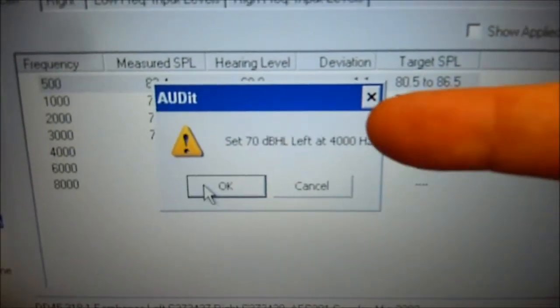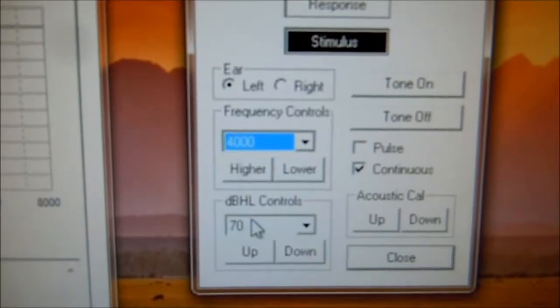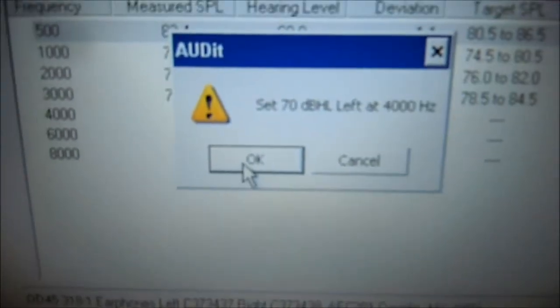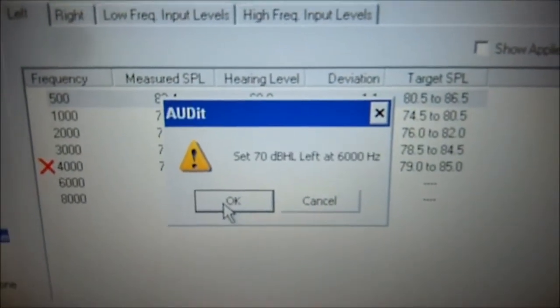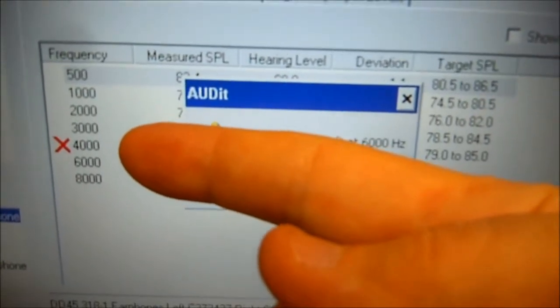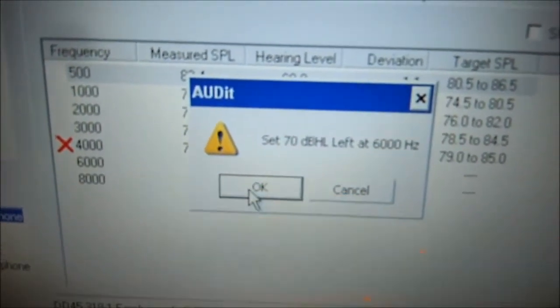Now it asks 70 dB at 4,000. Come back to the audiometer software, select 4,000, 70 dB. Tone's already on. Come back to the audit software and press OK. Now it says 70 dB at 6,000. Also notice off to the left here there's an X — that means that at 4,000 Hz the audiometer failed. So we'll go back after we've done up to 8,000 Hz and we'll adjust it.